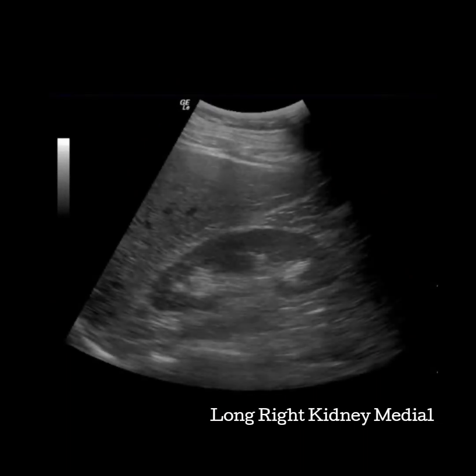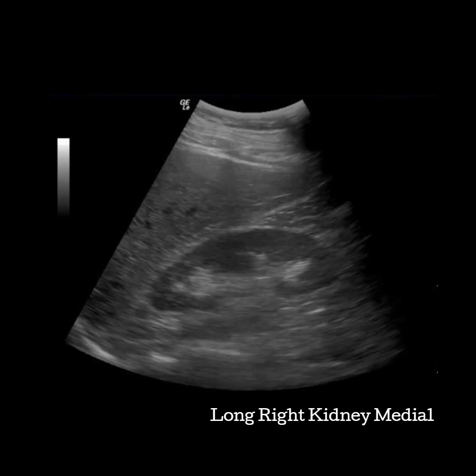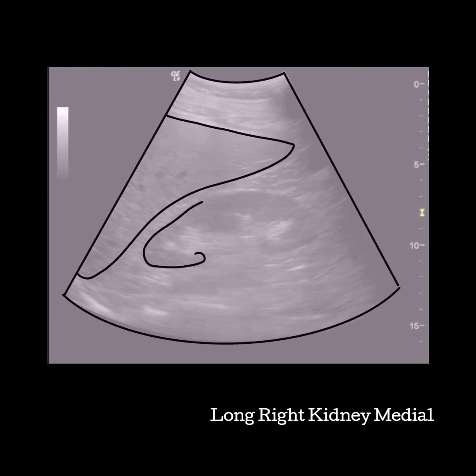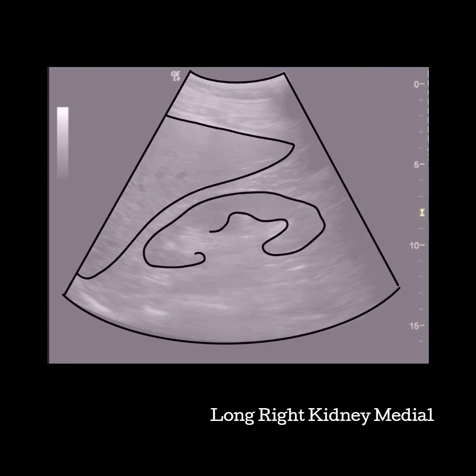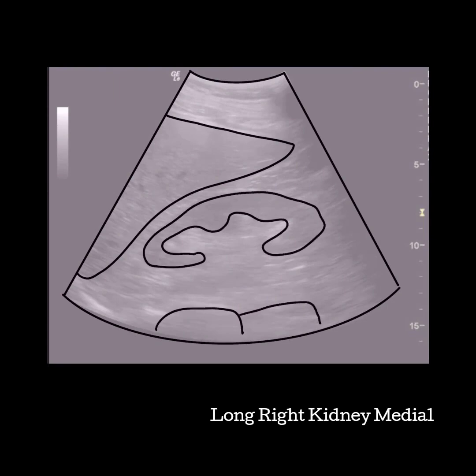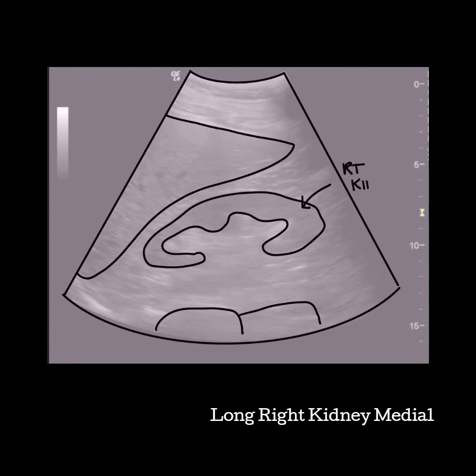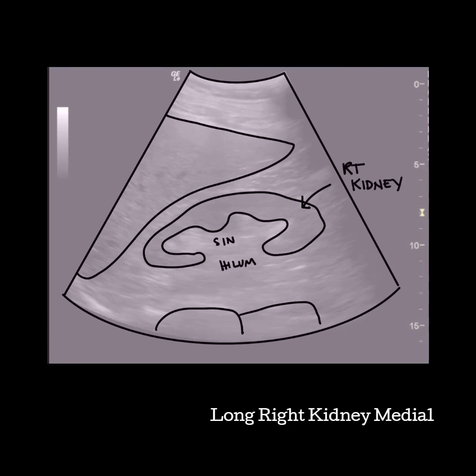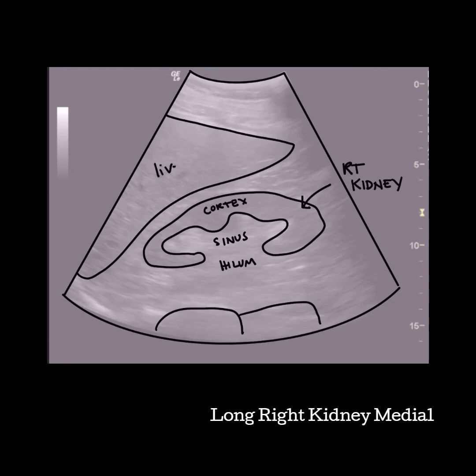Continue moving the transducer towards the patient's center. Watch for the poles of the kidney to become rounded again. The central portion of the cortex will give way at the hilum. Watching for the kidney to make more of an old telephone shape, the cortex appears to split at the hilum. This is where the renal vein and ureter exit and the renal artery enters. The liver is still seen superiorly.